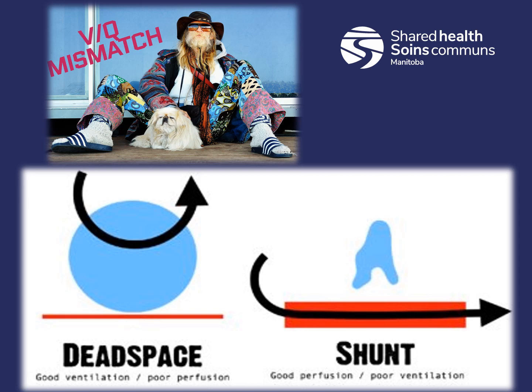When we talk about dead space, there are three types. First being anatomical dead space. Remember that this is phase 1 of the waveforms. The anatomical dead spaces are areas of the respiratory tract that do not contain alveoli, that being the trachea, bronchi, and bronchiole. The second dead space we're going to talk about is the airway equipment used in ventilation. And then the third is focusing on physiological dead space.